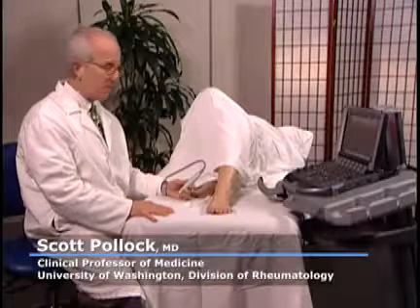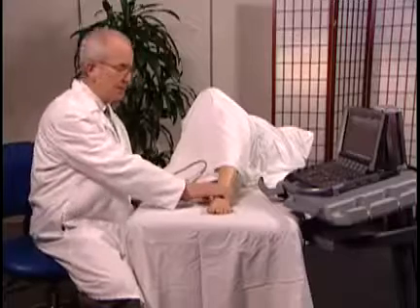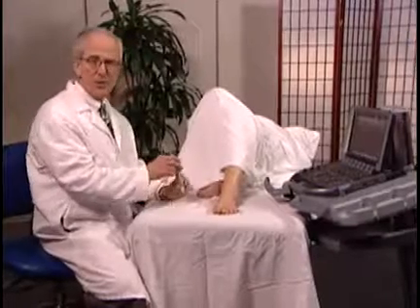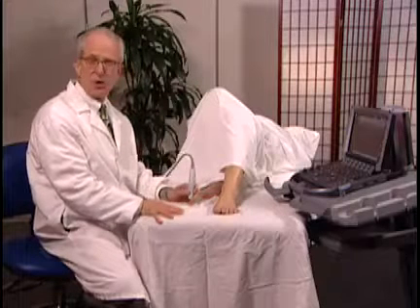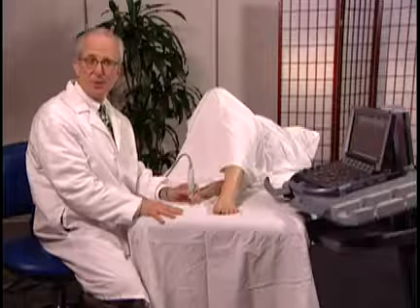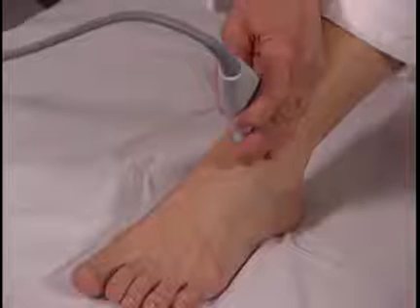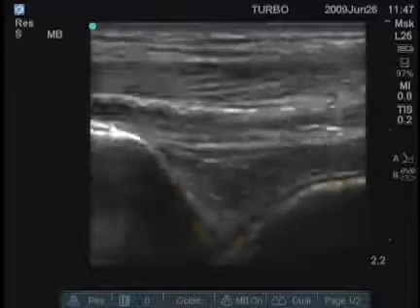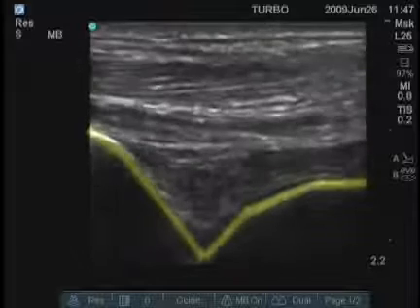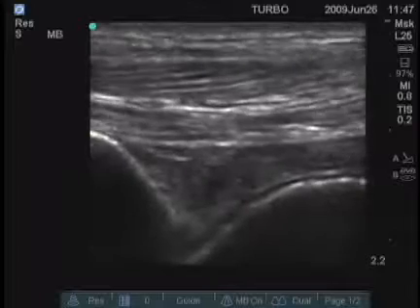Injection or aspiration of fluid from the ankle is best obtained most of the time anteriorly, but it really depends on where the fluid is most easily visible, where the blood vessels are, and what the best approach is for the angle of the needle. This is the joint we would be aiming for, right at the base of that V, and if there were fluid there we'd see it as a black area filling in the base of the V.